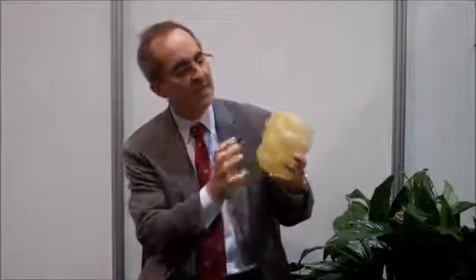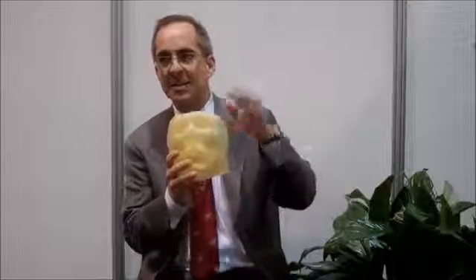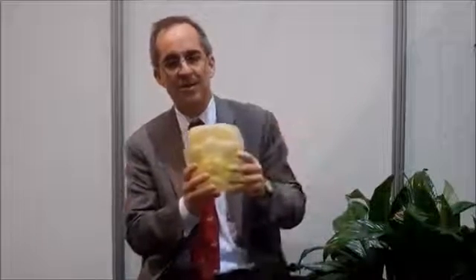And you can see now a very thick, robust face. This actually weighs over twice what the other one does, and the volume, the weight correlates to the volume of the tissue that she has. And now you can also see the accuracy by putting the bone model into her current face, and as we showed at RSNA 2014, this is a rather accurate description and a way to appreciate the soft tissues that she has today. And so we're able to see the changes over time and even keep these models and document those soft tissue changes over time.